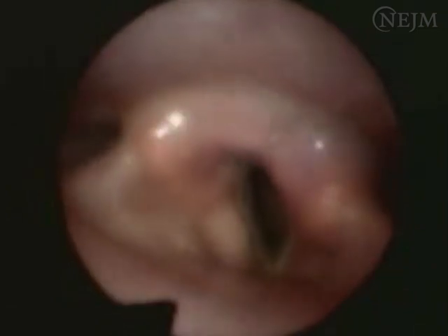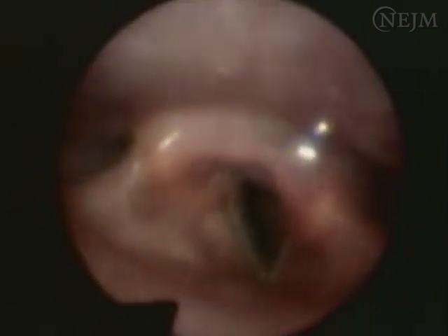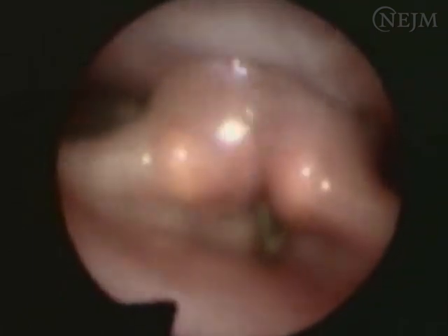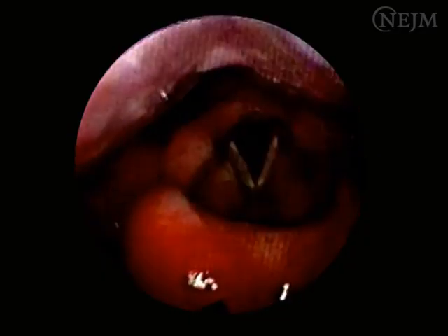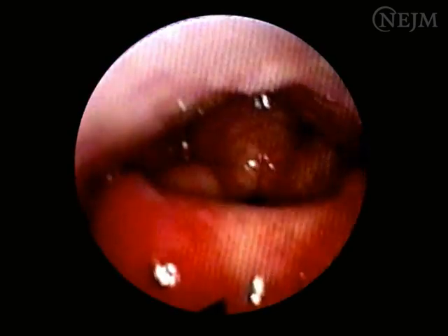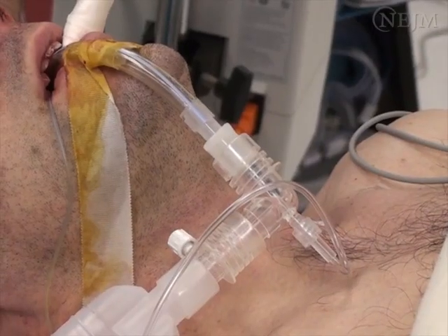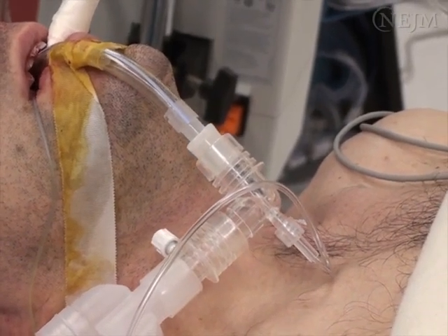Vocal cord dysfunction is a rare cause of airway obstruction and, if present, may require immediate re-intubation. Suspect vocal cord dysfunction if the team thinks that the recurrent laryngeal nerves might have been injured. Patients with laryngeal edema due to prolonged intubation or direct glottic compression can present with delayed airway obstruction and inspiratory stridor. Impaired airway and swallowing reflexes can pose a risk of pulmonary aspiration.